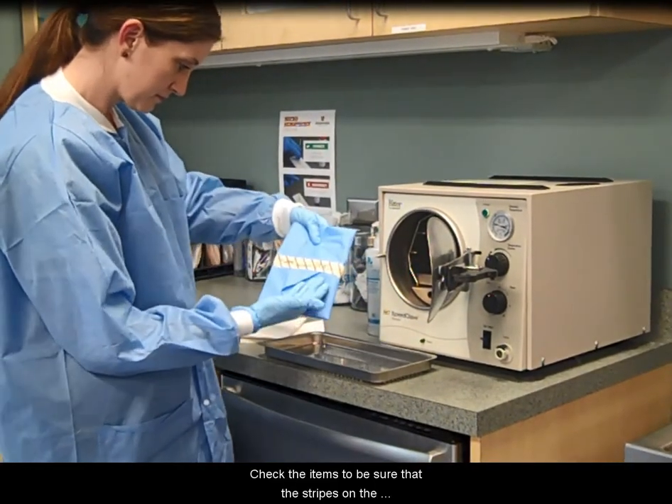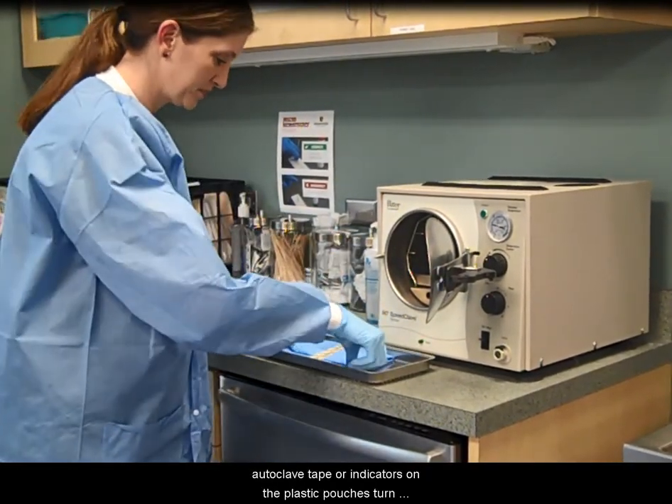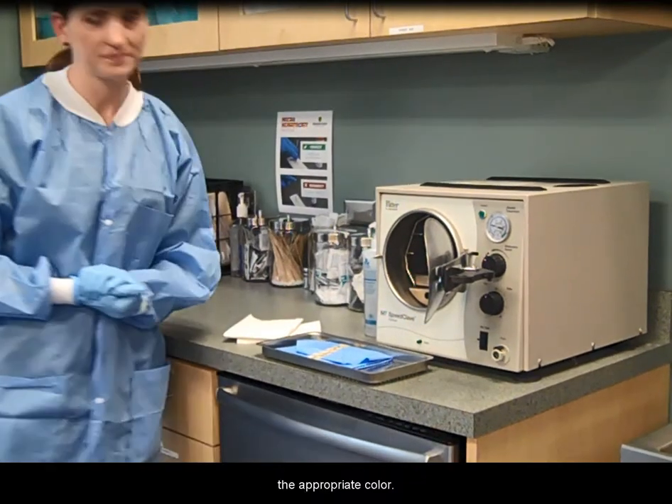Check the items to be sure that the stripes on the autoclave tape or indicators on the plastic pouches turn the appropriate color.